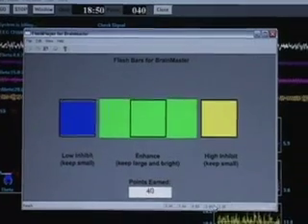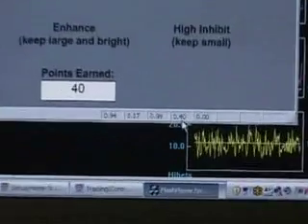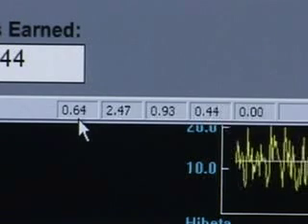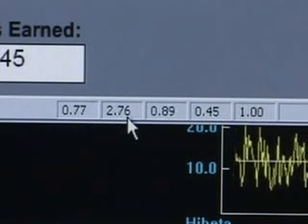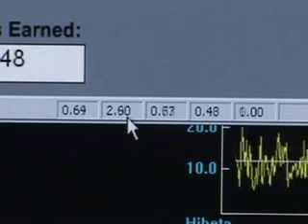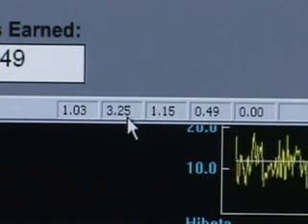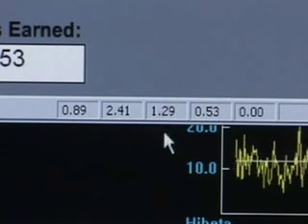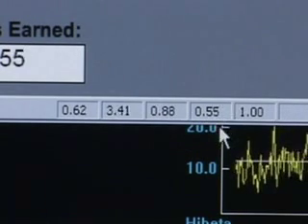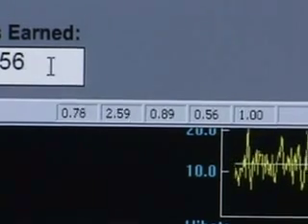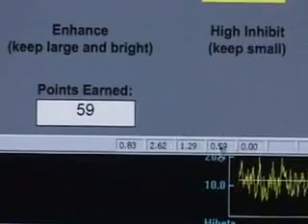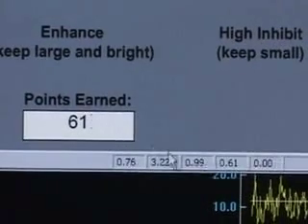If we look closely at the lower right-hand side of the flash games, we see our five variables. We have the ratio of theta here — the theta threshold going below and above one. We see the beta ratio to its threshold, typically larger than one because it's over threshold. Here we have the high beta again relative to its threshold. Here we see our points divided by 100, and if we look back at the points window we see 56 points — that was divided by a hundred — so everything's working properly.